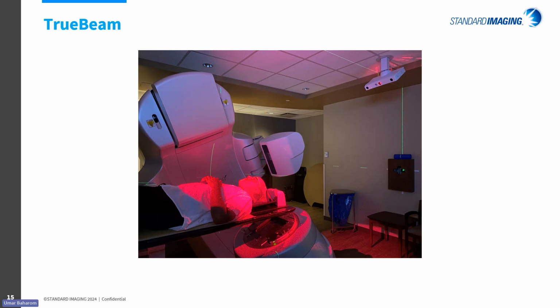We have tested the couch angles, and generally couch kicks up to 45 degrees are available, with field sizes less than 5 cm, but certainly you want to take a look at your plan as you use the device.